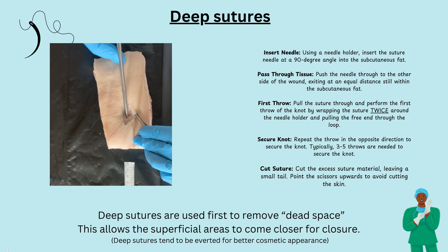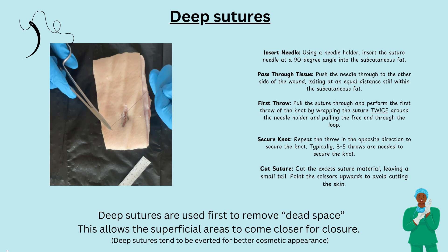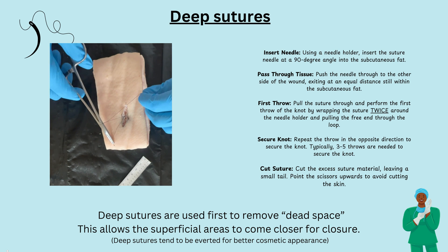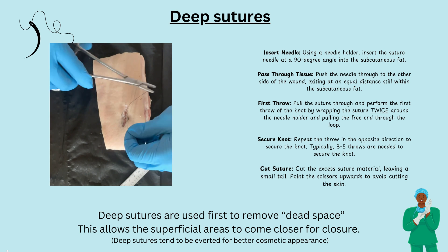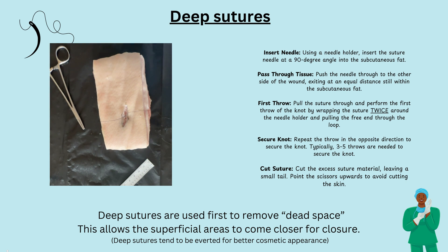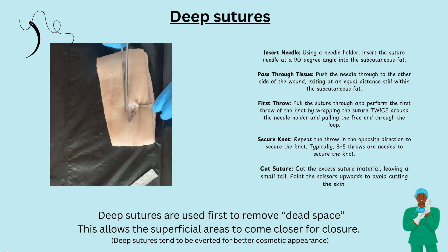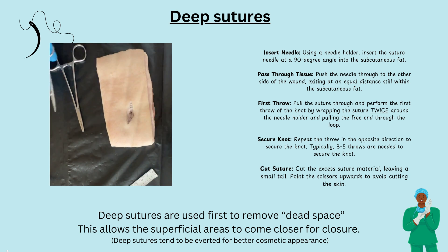Using a needle holder, insert the suture needle at 90 degrees into the subcutaneous fat. Push the needle through the other side of the wound, exiting at an equal distance still within the subcutaneous fat. Pull the suture through and perform the first throw of the knot by wrapping the suture twice around the needle holder and pulling the free end through the loop. Repeat the throw in the opposite direction to secure the knot. Typically three to five throws are needed. Cut excess suture material.